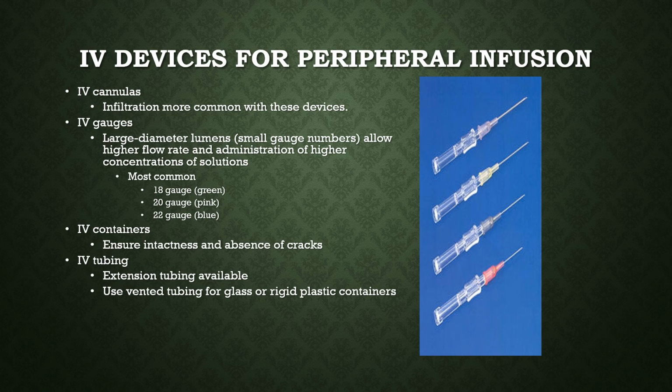It is a device that goes into a vein, and then it is secured down, and then you can run continuous fluids in it, or you can just give medications periodically or fluids periodically. However, in order to keep it from clotting off, if you're not running fluids continuously, you'll need to flush it intermittently, or it will clot. It'll get a clot in the end of the catheter.